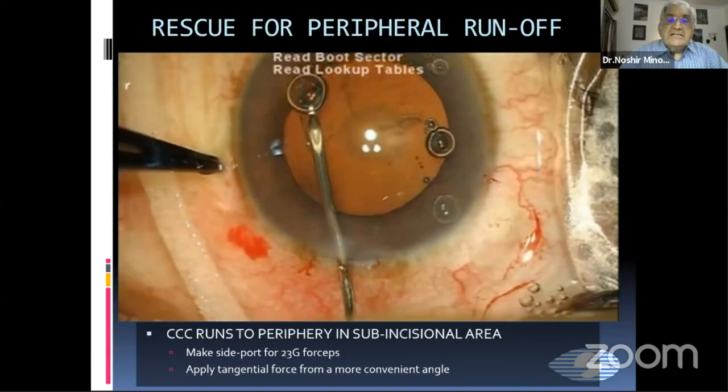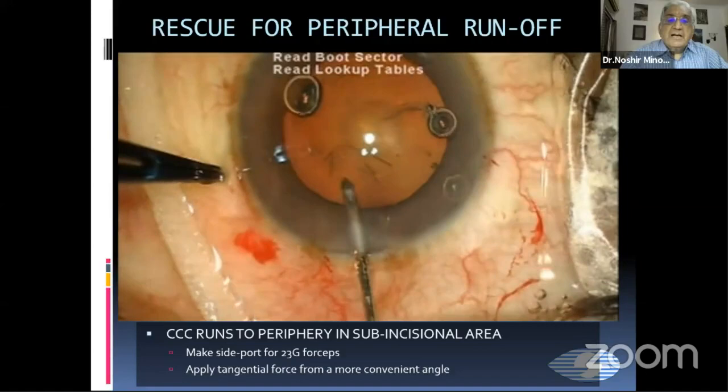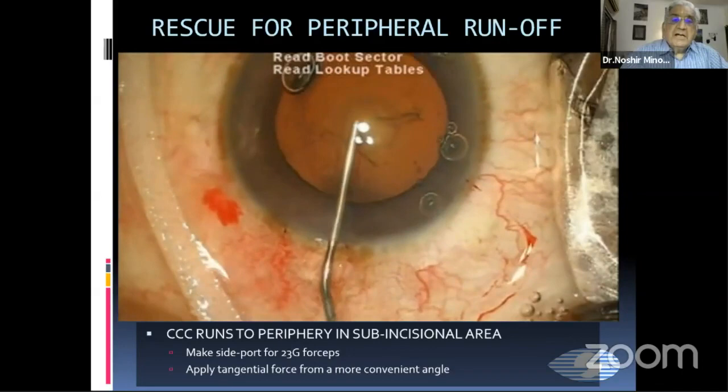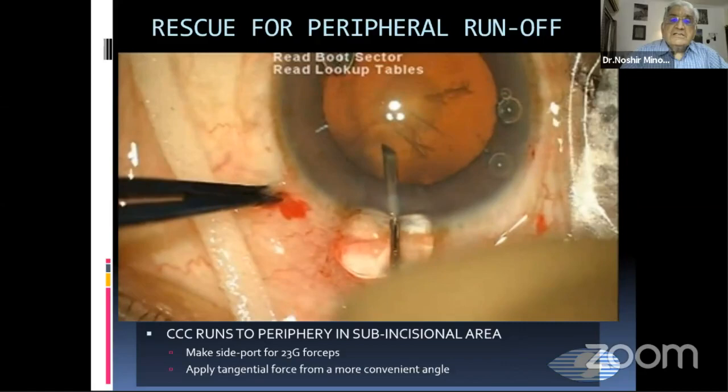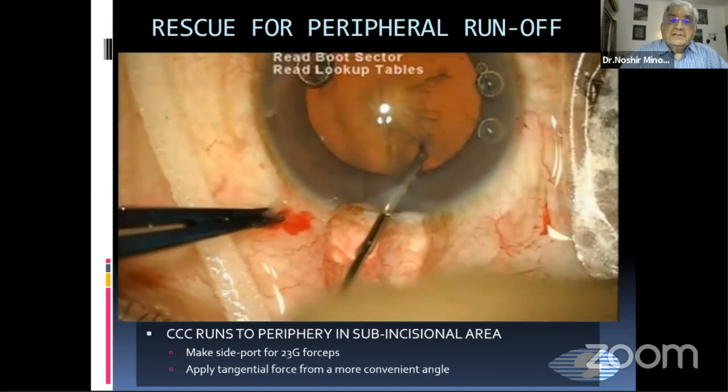Again, this is a capsulorhexis trying to run to the periphery. As you will see, you are going on well, and suddenly it starts going to the periphery. You can see the edge quite well, and it's going to the periphery. We inject viscoelastic and try again, applying tangential forces. But again, it is not going to the center even in spite of all the tangential forces with the needle.